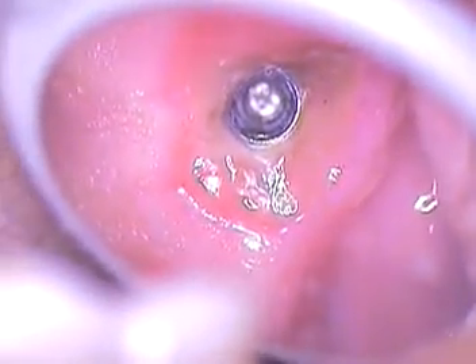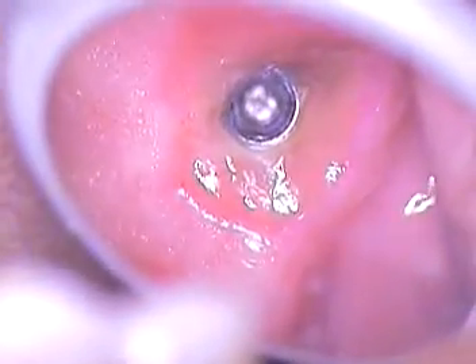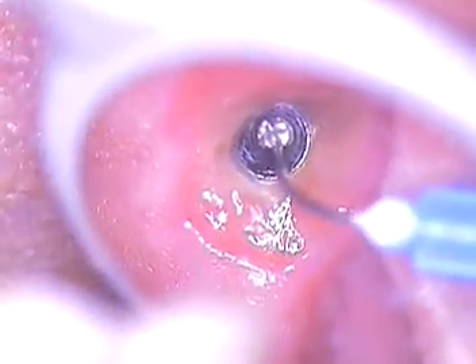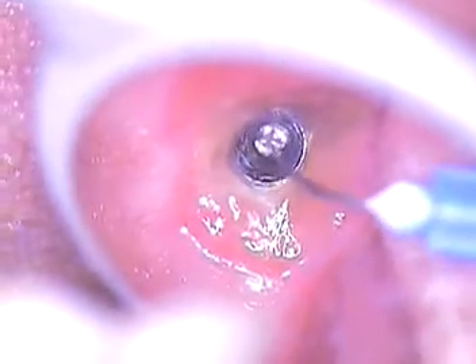What we proceeded to do in my office is to go ahead and pre-soak with the tartar and stain TNS solution. I'm going to go ahead and place some more TNS in there. Now that both screws are loose, we'll let it penetrate any further.